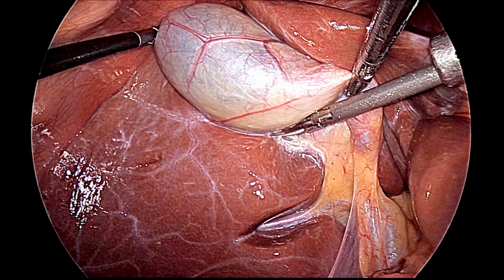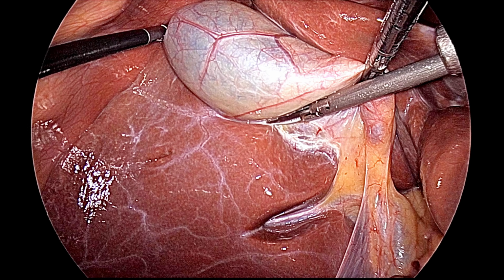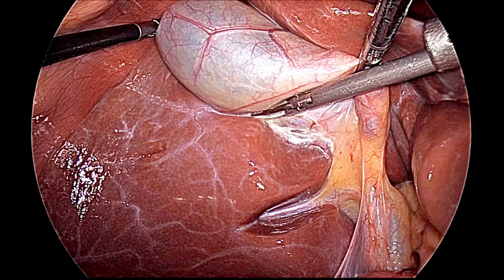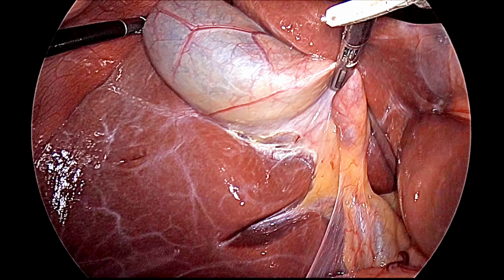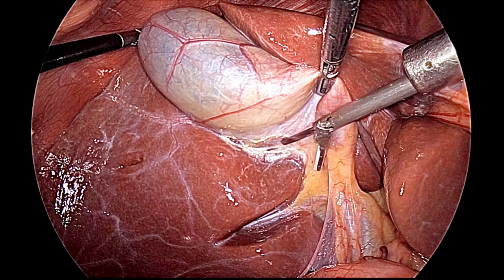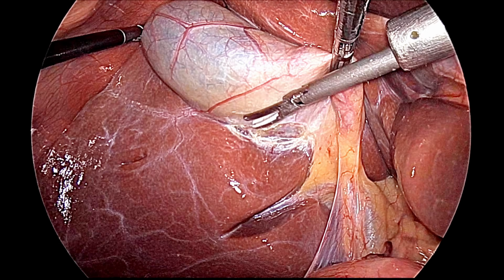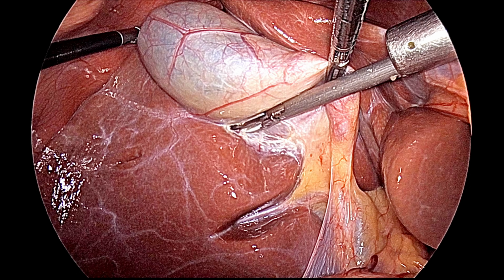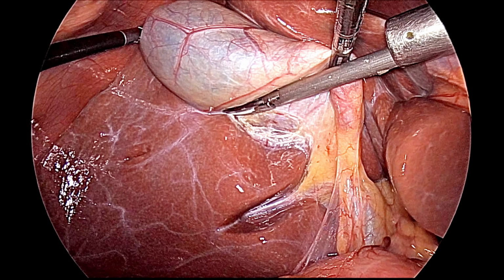Either you can use the harmonic scalpel or you may use the hook also. This is personal preference. Some surgeons use scissors as well, and only the peritoneum should be cut. The left hand must give the anteromedial traction so that the peritoneum will be exposed and you can cut it. If the peritoneum is under tension, there will not be any rupture of the gallbladder. If you keep it loose, then it may puncture.